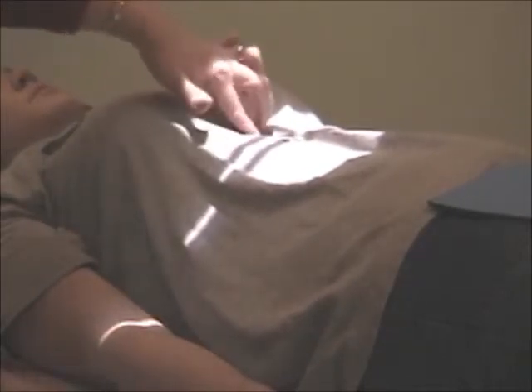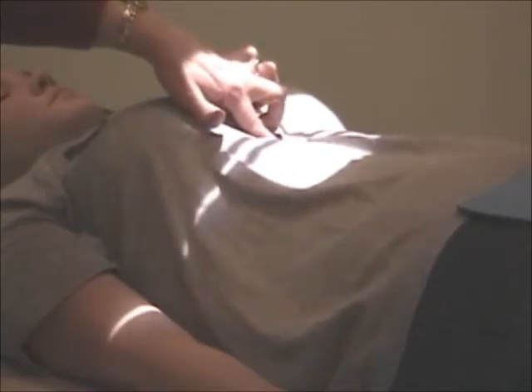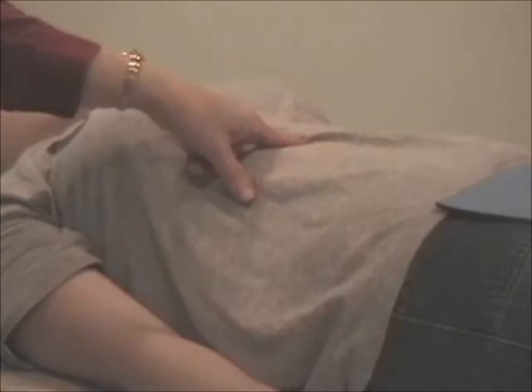If she was hypersthenic, we'd be level with the xiphoid. This is sthenic, 1 inch below the xiphoid. Hypersthenic is 1 inch above the standard line, which is actually right at the xiphoid. And then hyposthenic is 1 inch below, and asthenic is 2 inches below the sthenic mark.